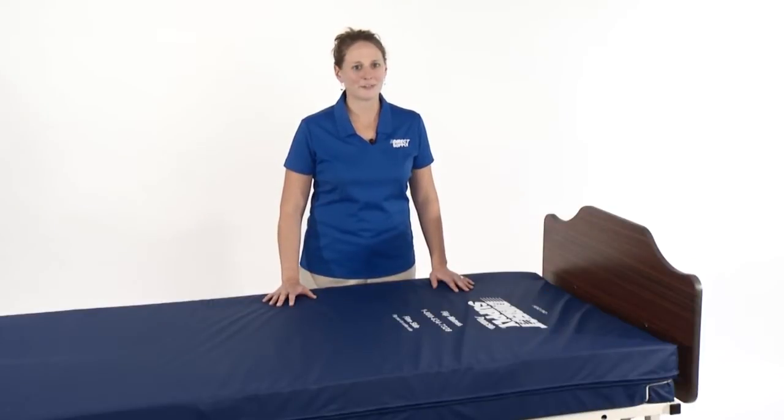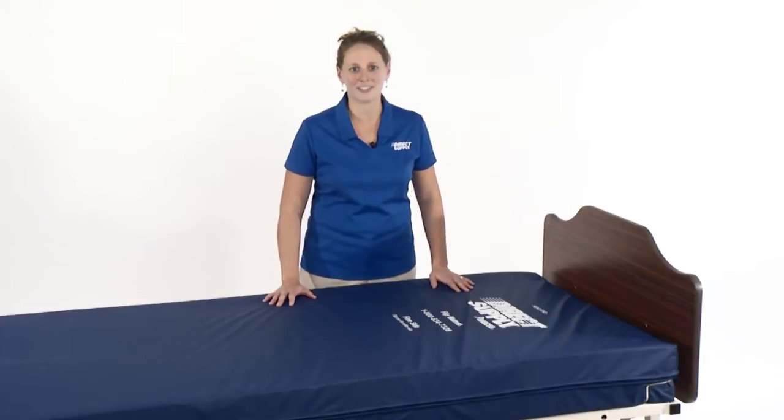Introducing the Direct Supply Panacea Flip Mattress, a convenient way to cater to your resident's comfort needs. Hello, I'm Carrie Harbaugh, product consultant with Direct Supply, and I'm excited to introduce one of our newest mattresses to you today.